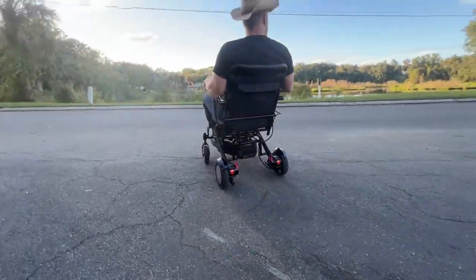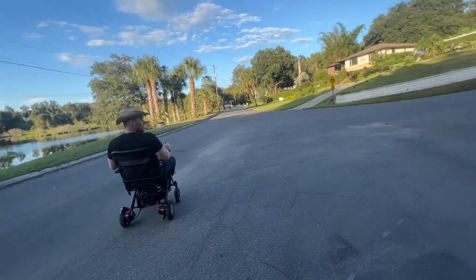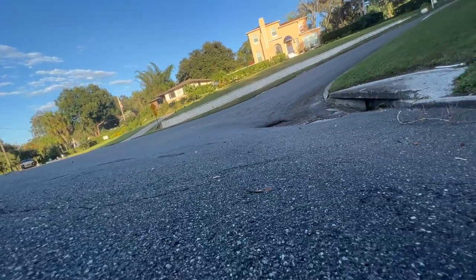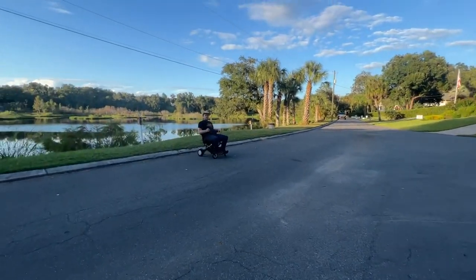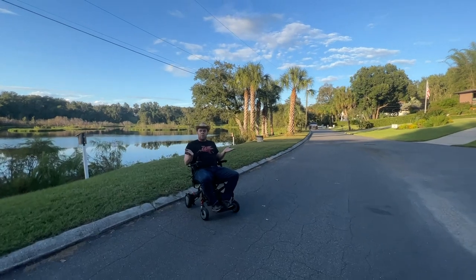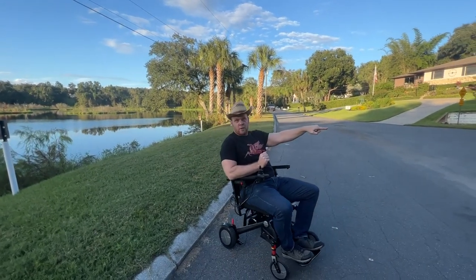That was really steep — more than an ADA ramp right there, and it's not level. The Matrix handled it no problem. You can see I took this chair through a very challenging environment.